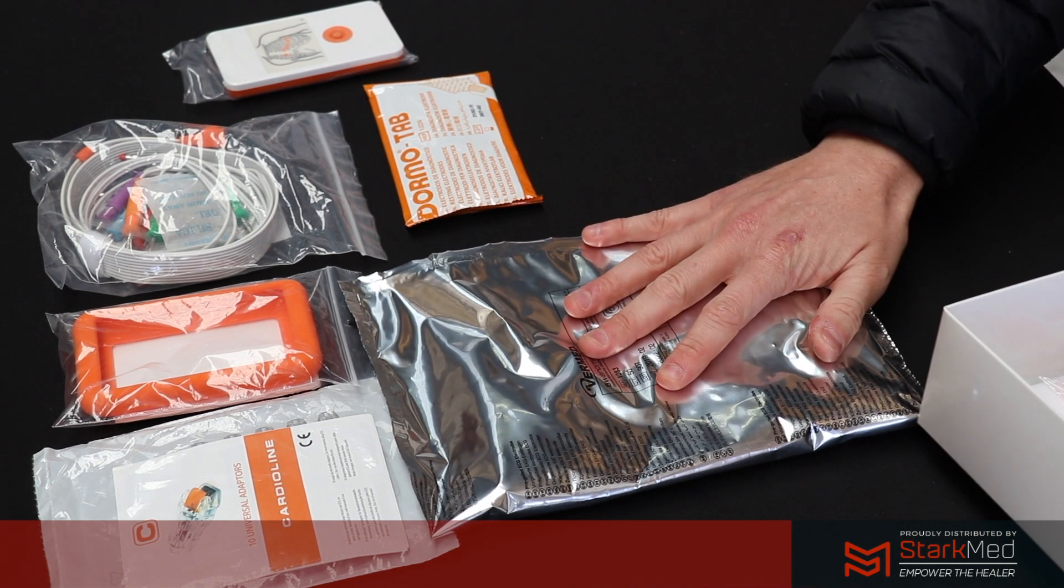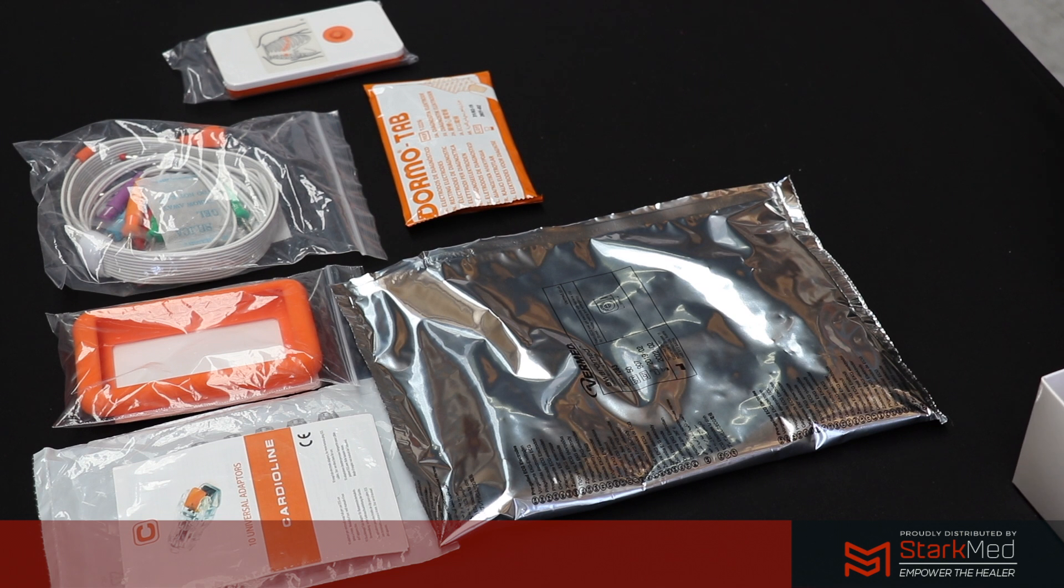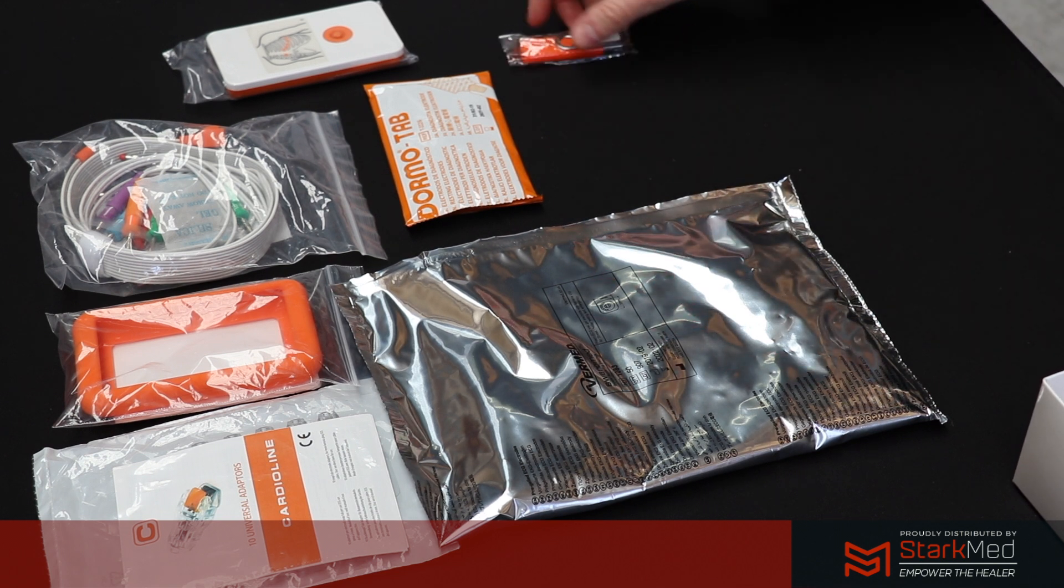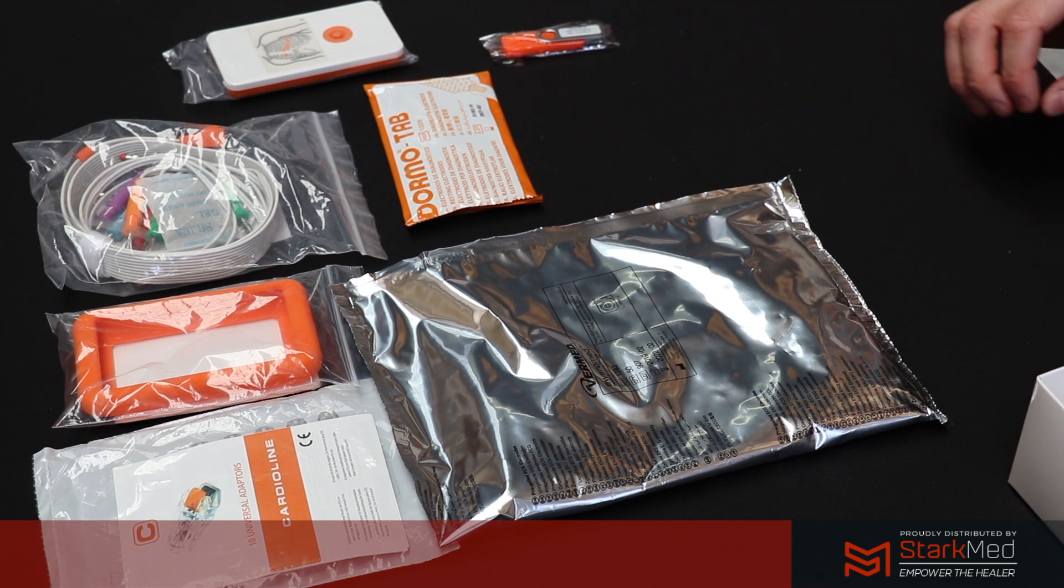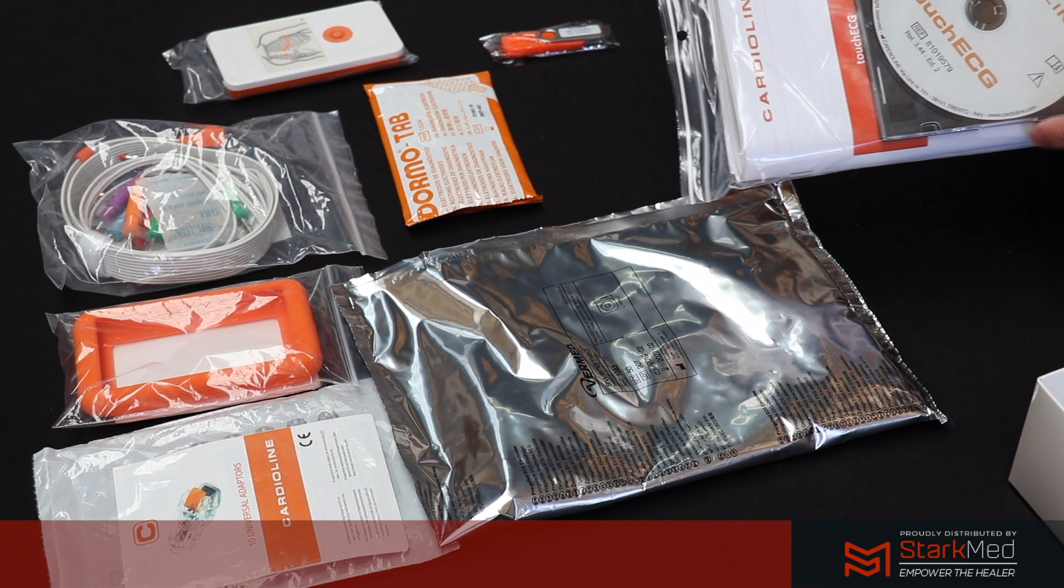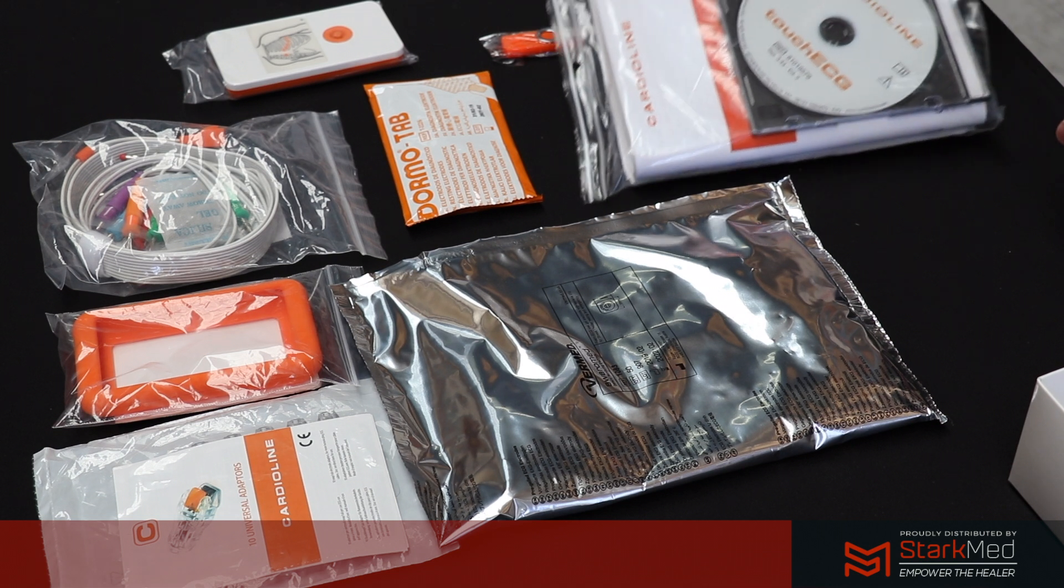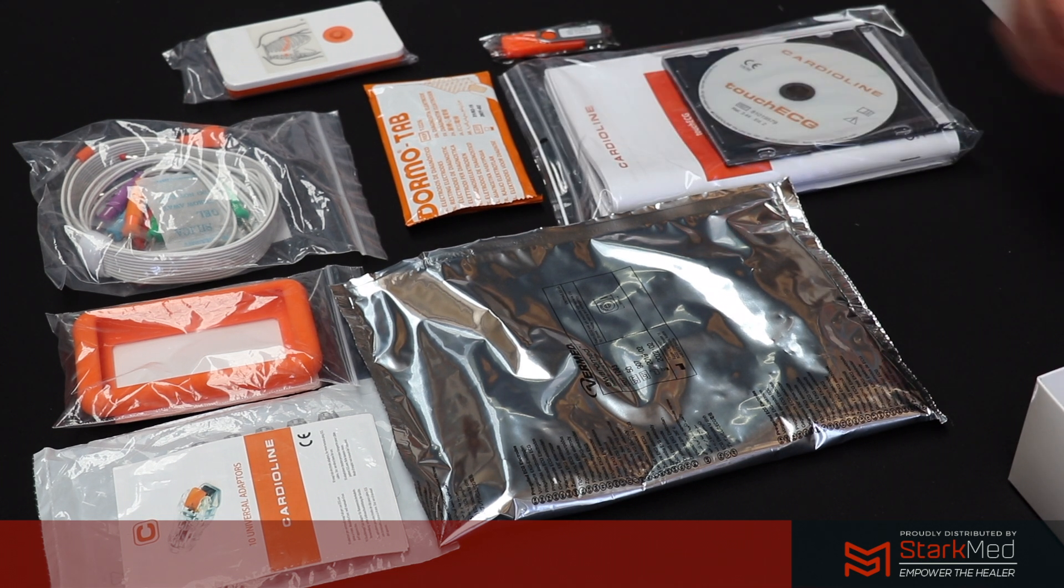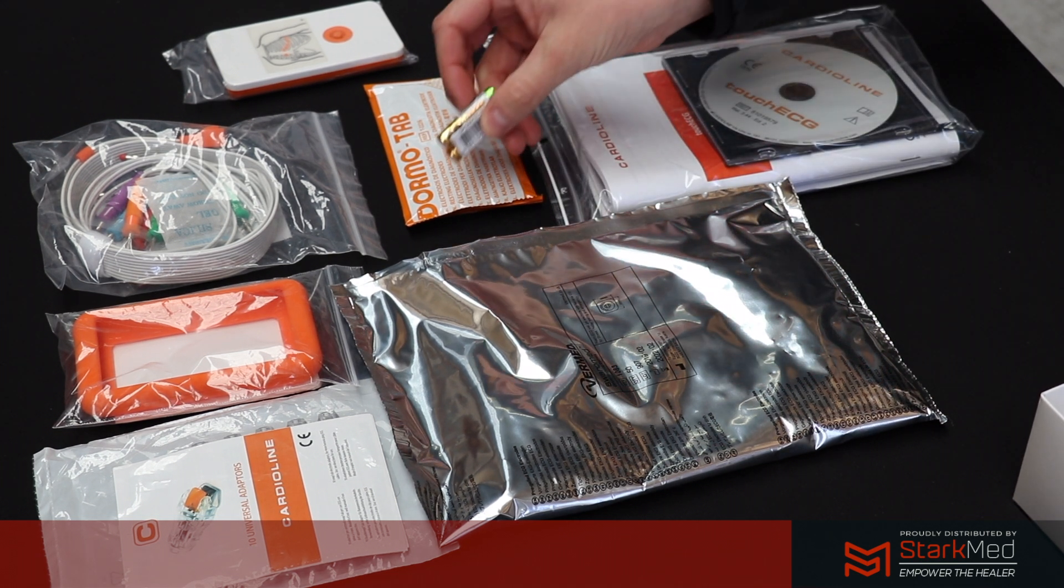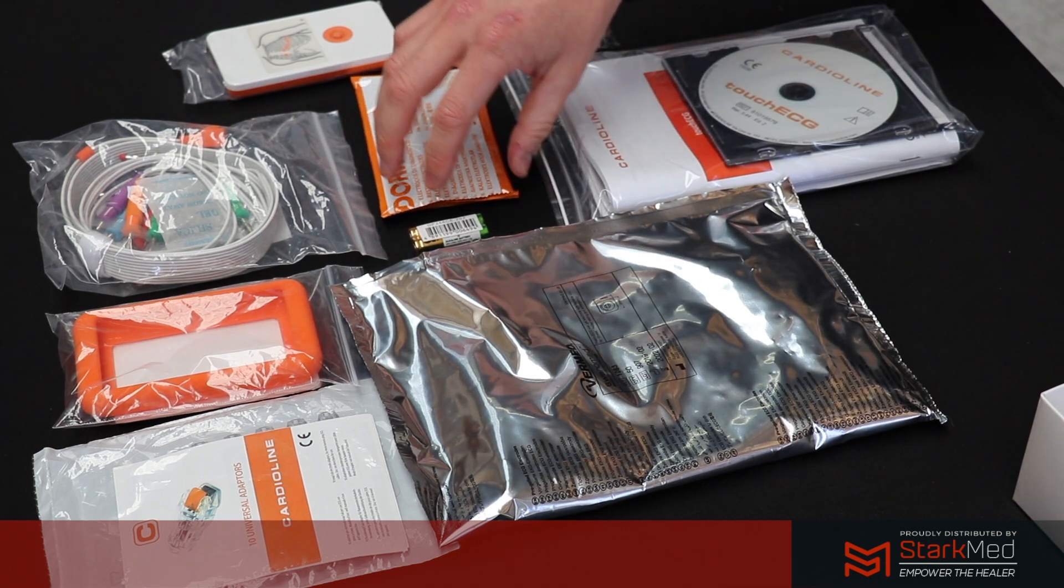In here you'll also notice the Touch ECG software dongle for downloading purposes. There's also a CD that you can download the software with and your user manuals. Also in the packet you'll receive a set of AAA batteries.